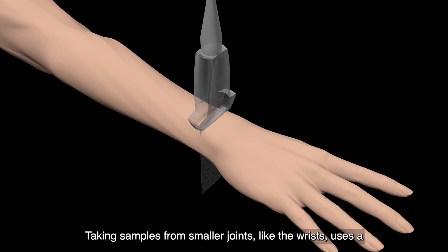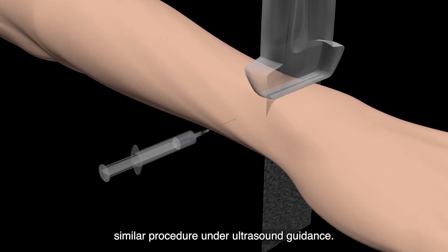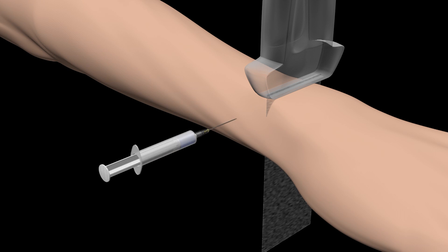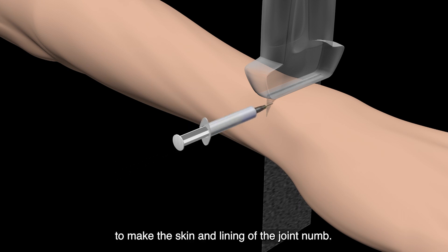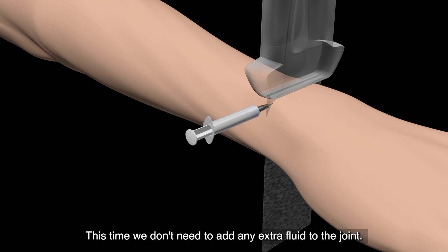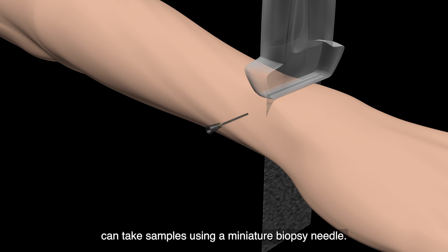Taking samples from smaller joints like the wrists uses a similar procedure under ultrasound guidance. Just as before, we use local anaesthetic to make the skin and lining of the joint numb. This time we don't need to add any extra fluid to the joint. We insert an even smaller portal tube, through which we can take samples using a miniature biopsy needle.